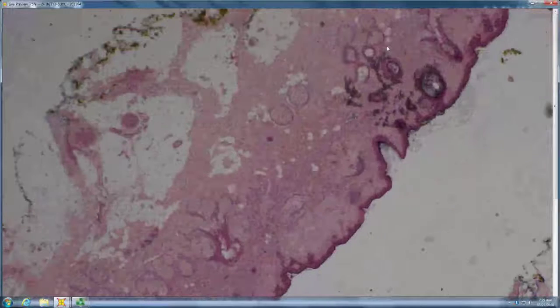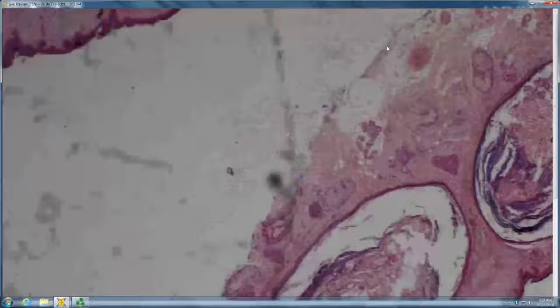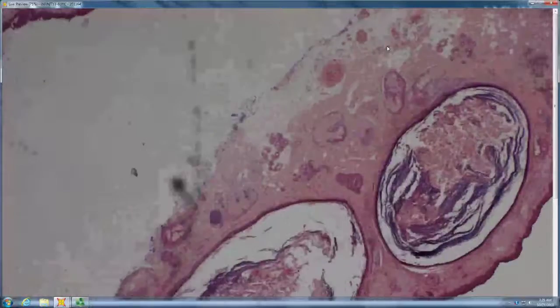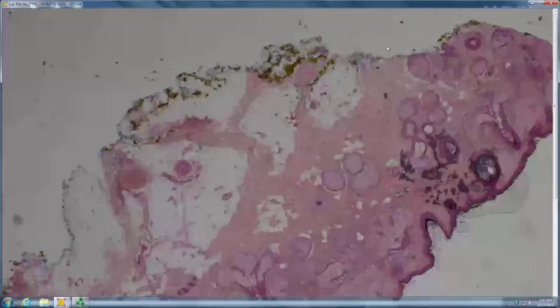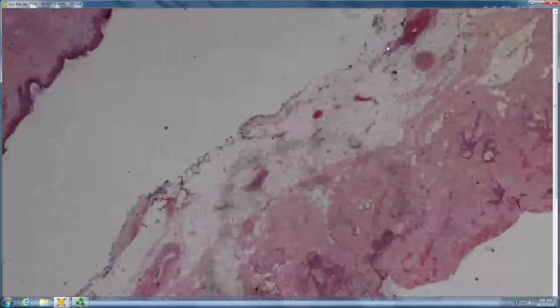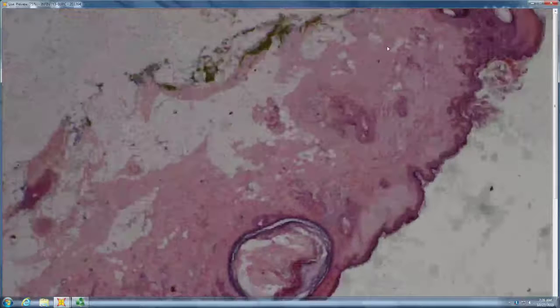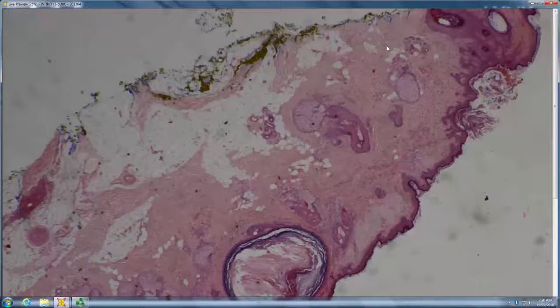Keratin-filled cysts. Some keratin-filled cysts on fairly sebaceous skin and lots of elastosis, and the smoker. So-called smokers' comedones or Favre-Racouchot syndrome, which is a manifestation of chloracne from all the hydrocarbons you're inhaling with the cigarette smoke. And like other forms of chloracne, you can get clear fluid-filled cysts, you can get keratin-filled cysts and comedones, and nodular elastosis. So the other descriptive name, nodular elastosis with cysts and comedones, for smokers' blackheads, lots of names for them.